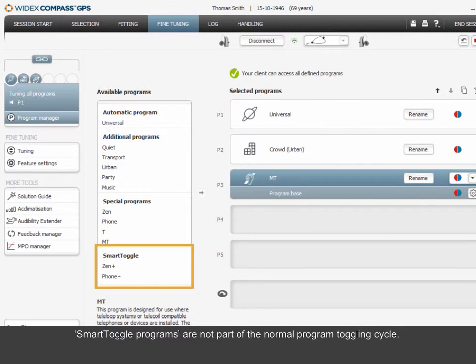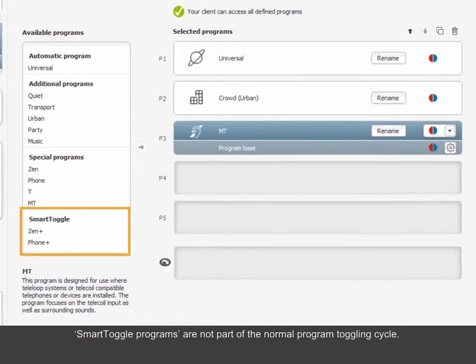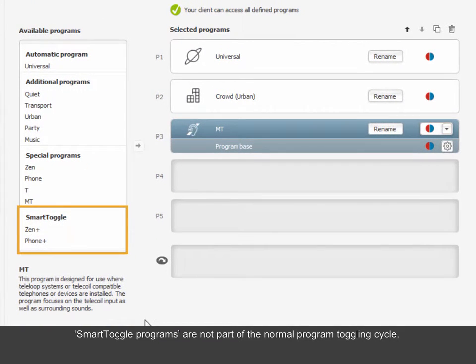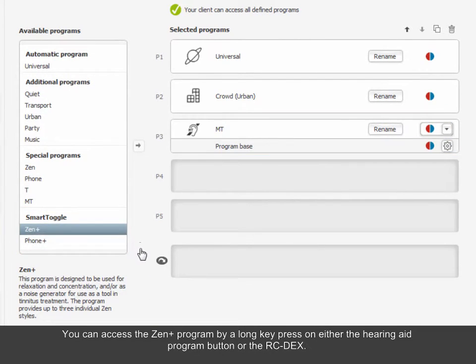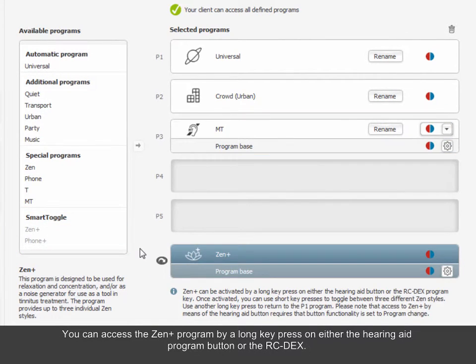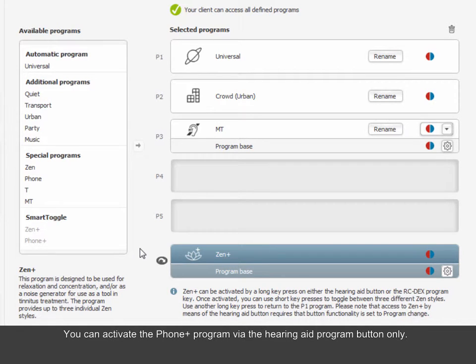Smart toggle programs are not part of the normal program toggling cycle. You can access the Zen Plus program by a long key press on either the Hearing Aid Program button or the RC Dex. You can activate the Phone Plus program via the Hearing Aid Program button only.